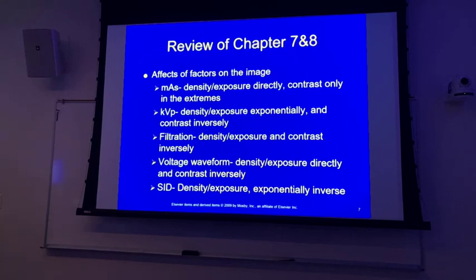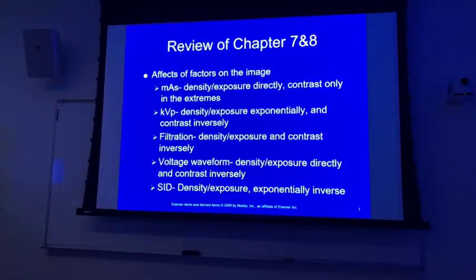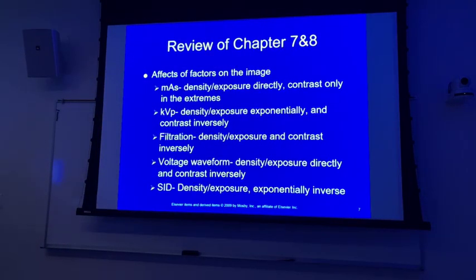For the most part, your kVp is the thing that you routinely use to affect a change in energy, which in turn affects your scatter radiation.